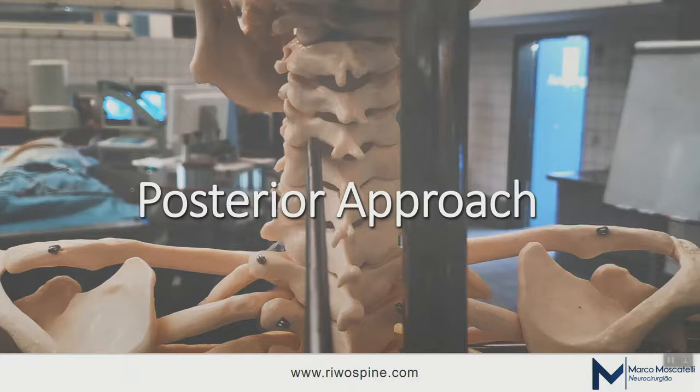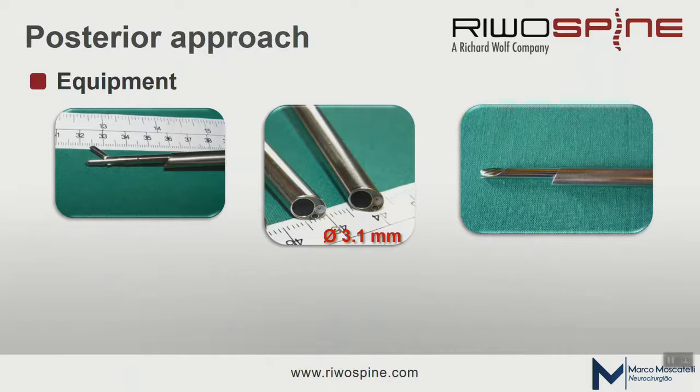Posterior approach. Cervical endoscope material is more delicate than the lumbar interlaminar material, but everyone asked me if my surgery with the interlaminar material is possible. Yes, it's possible, and my surgeries are done with this material here in Brazil, in all my cervical cases. The posterior access to the cervical spine is restricted to the foraminal and lateral pathologies, or where it is not necessary to have contact with the median extrusions. With this, it is possible to resect lateral foraminal disc herniation and perform foraminotomies.